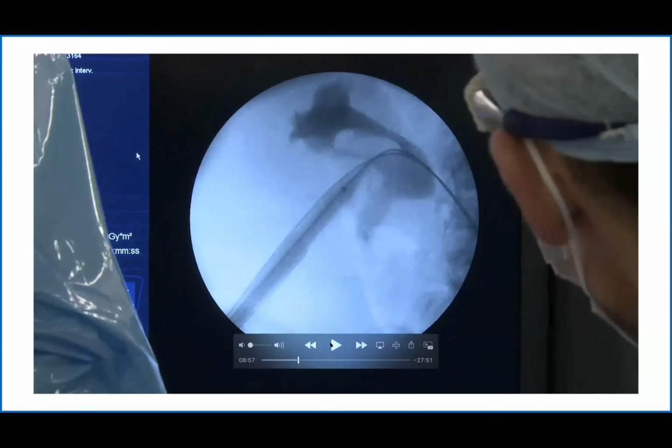Just a question from Graham about the exposure that we're getting from the II there. He's suggesting that there's quite a lot of X-ray being done there. What are some of the methods that are done to minimize the exposure to X-rays, and what are your thoughts about what he says? That's a very good question and a valid concern. The X-ray is controlled by the radiologists themselves, so they're fully aware of the radiation exposure. They do tend to cone in to get a very focused view in order to reduce the exposure. It's one of the things that they're very aware of.